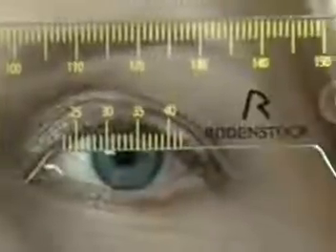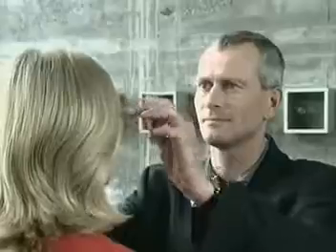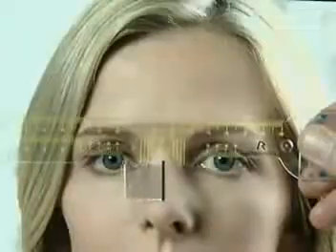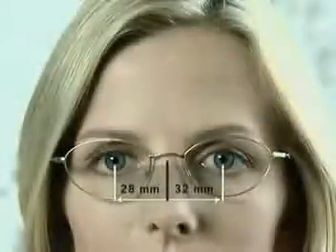Just place the tool at the root of the nose and instruct the patient to focus alternately on your left and right eye in order to exclude any possibility of incorrect measurement due to convergence. Read off the value at the point the scale intersects the pupil center for both eyes separately. Now transfer the values to the dummy lenses and recheck the result with the marks on the lenses of the fitted frame. Because the critical feature for the calculation of Impression ILT is the distance from the center of the frame to the center of the pupil.